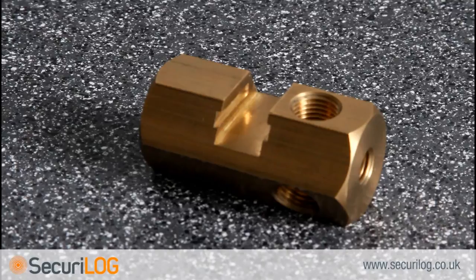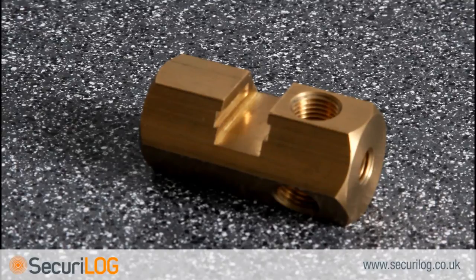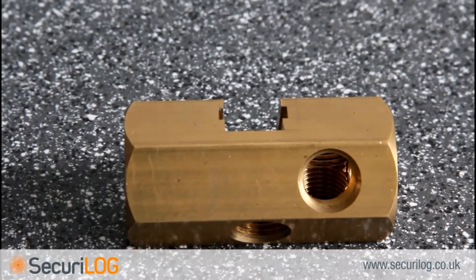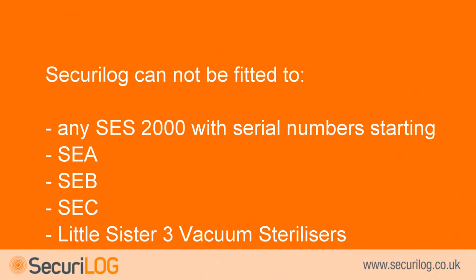If the manifold is the older type it will need to be replaced. It is important to note that a change in manifold will always require a recalibration of the main board. Secure log cannot be fitted to any SES-2000 steriliser with serial numbers starting SEA, SEB, or SEC, or Little Sister 3 vacuum sterilisers.